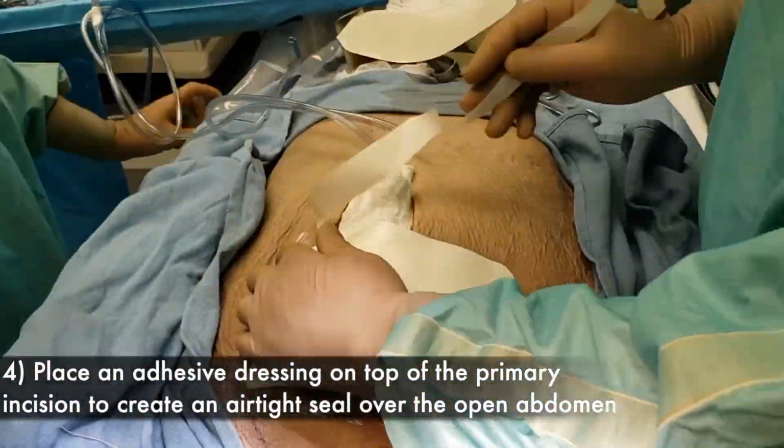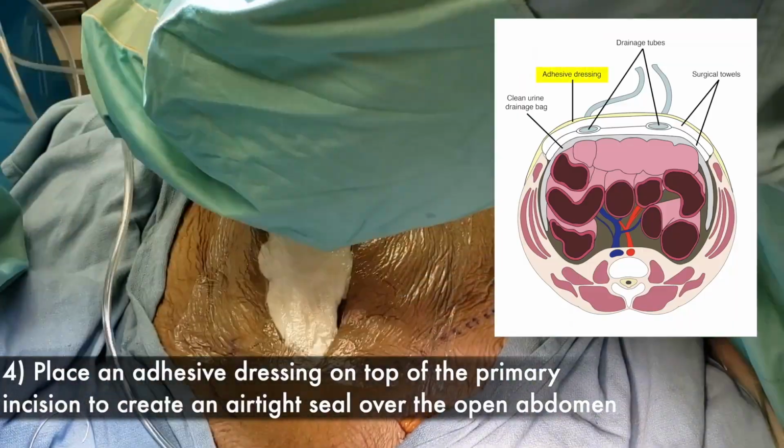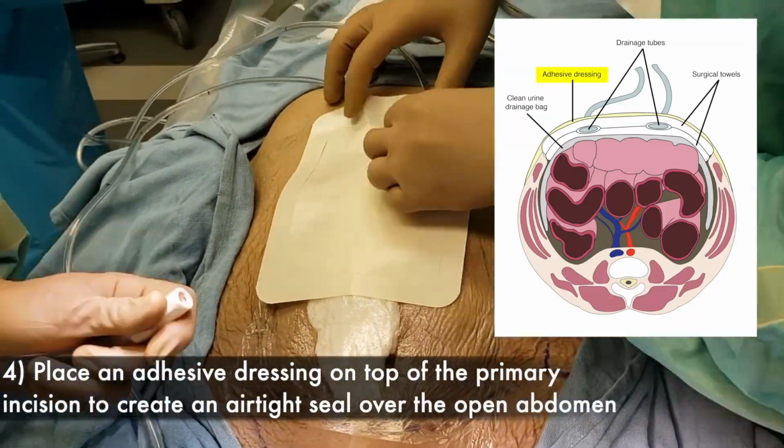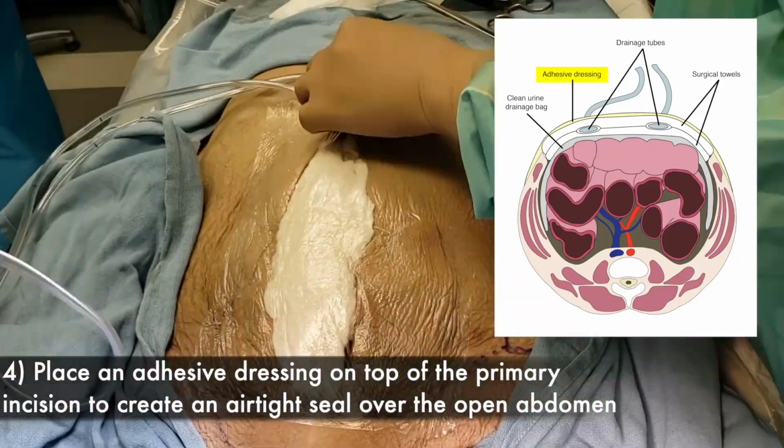Next, create an airtight seal by applying an adhesive dressing, such as an Ioban drape, to cover the wound and adjacent abdominal wall skin. Multiple adhesive dressings may be required to ensure the whole wound is covered.